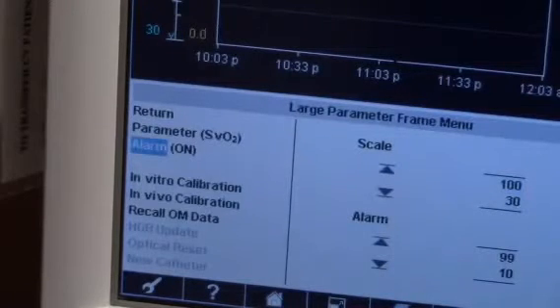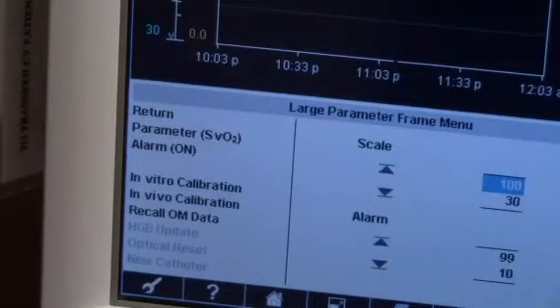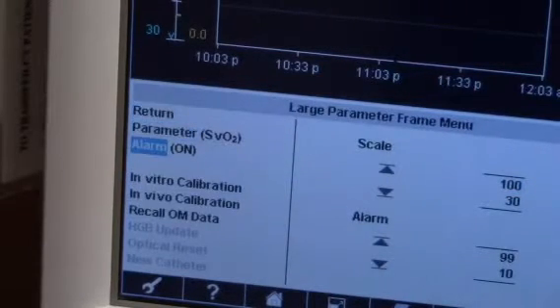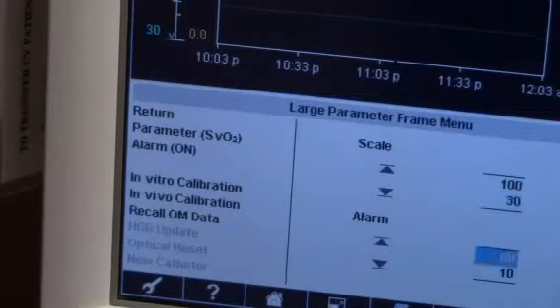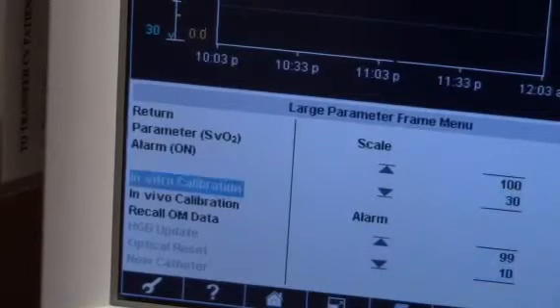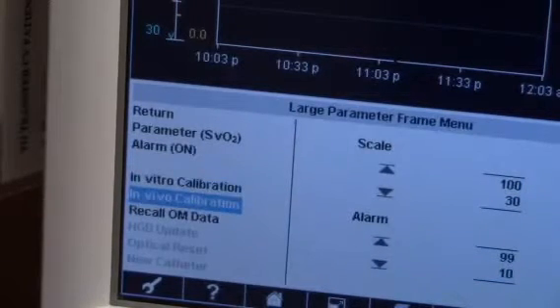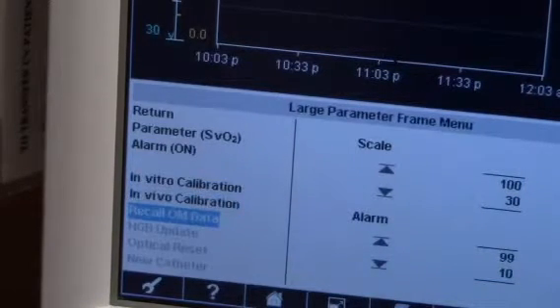Now use the navigation knob to recall OM data. OM means optical module. This takes a few minutes to display.